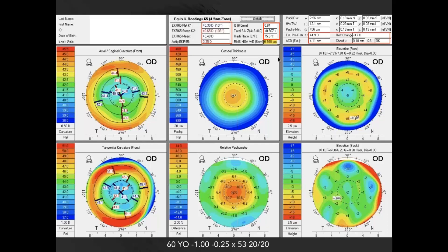The other information shown includes total spherical aberration. Not surprisingly, this is an oblate cornea after myopic LASIK with anticipated positive spherical aberration—0.6 RMS is a significant amount and accounts for the vast majority of the total higher-order aberrations of the cornea at 0.668. The Chord Mu value here is quite small, which is typical of a low-to-moderate myope where we really don't see large Chord Mu values.